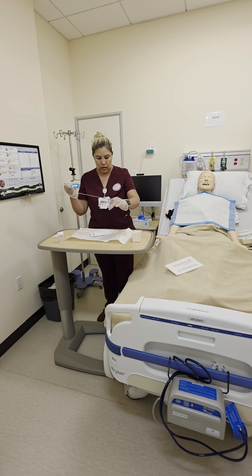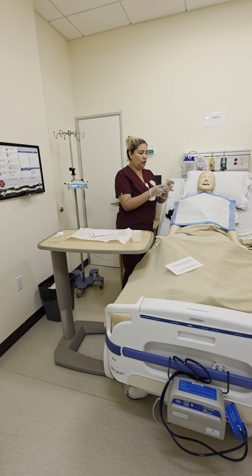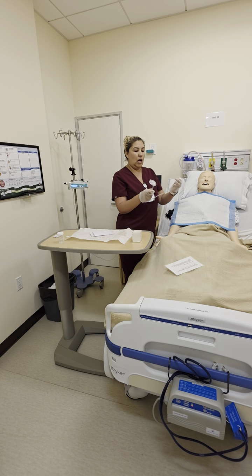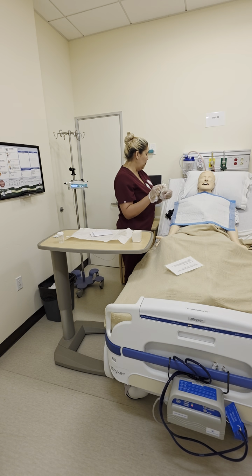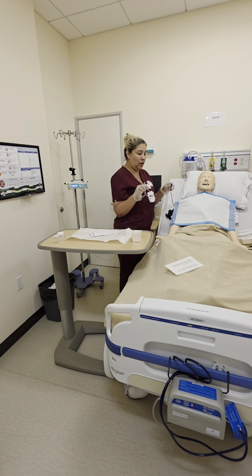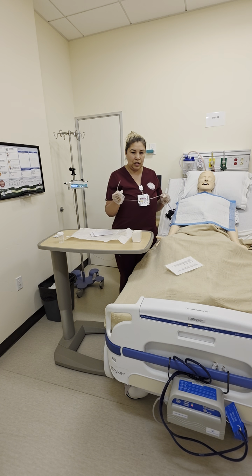I'm going to take out the oxygen, the suction, and like I mentioned, 3 to 4 inches. So now my dominant hand is my right hand, and that's the one that will remain sterile through the procedure. The left hand will no longer be sterile. I'm going to connect my tubing. Before I do that, I want to make sure that it works. It's on, it's suctioning properly. So I'm going to connect that, and my left hand, like I said, is no longer sterile.